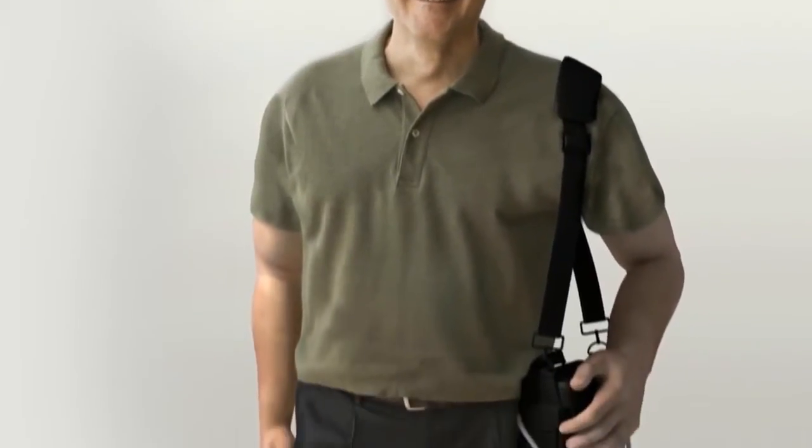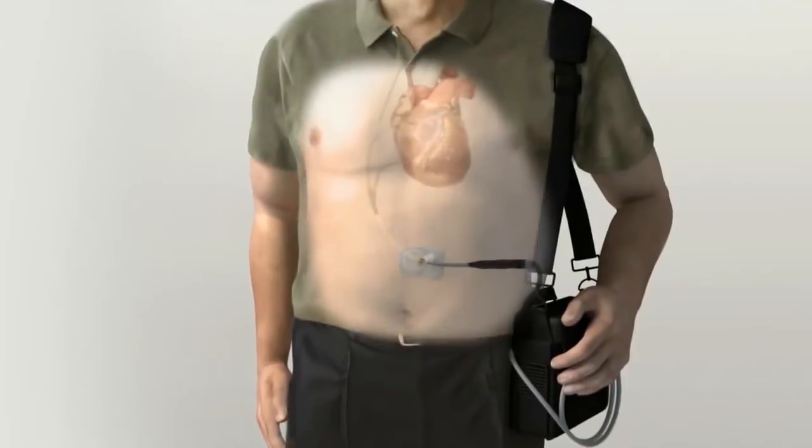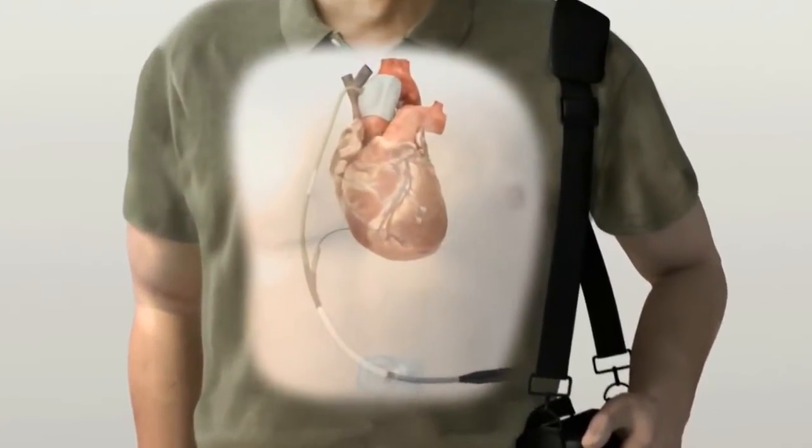The C-Pulse Heart Assist System is an extra-aortic balloon pump using well-understood counter-pulsation technology to treat moderate to severe heart failure.